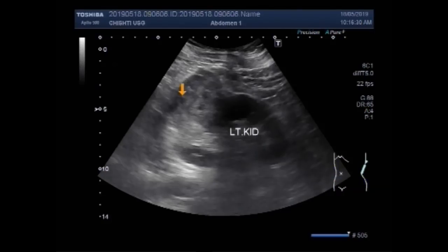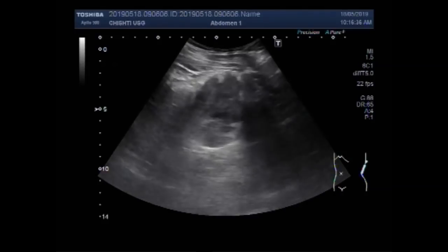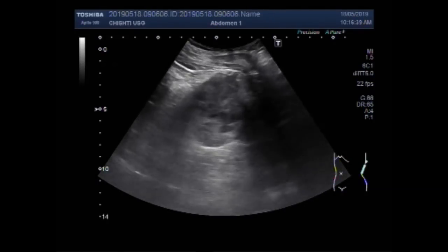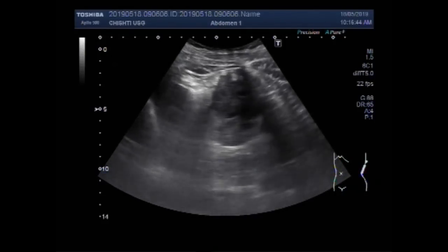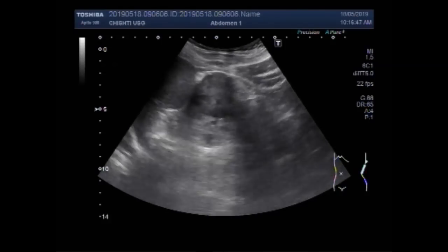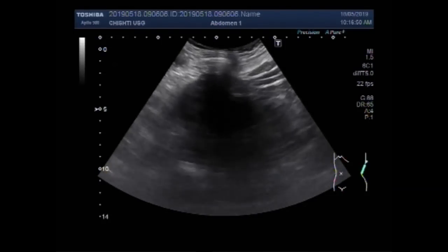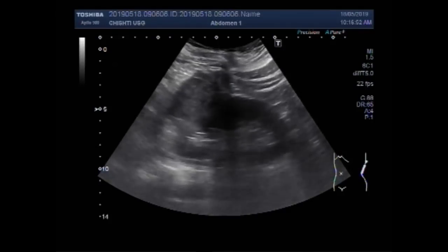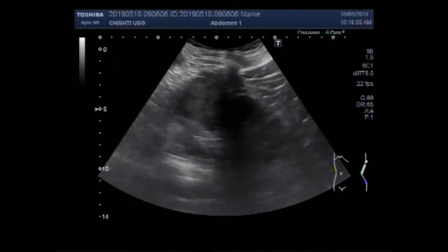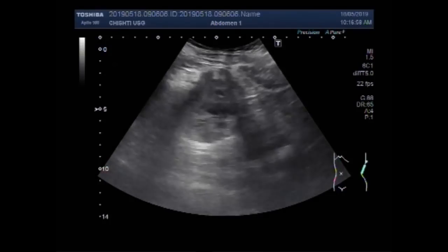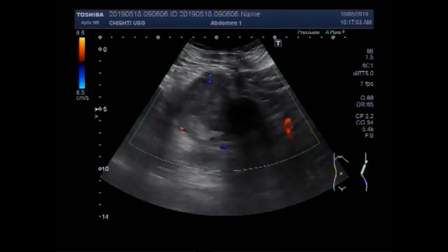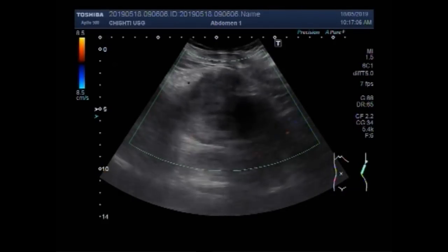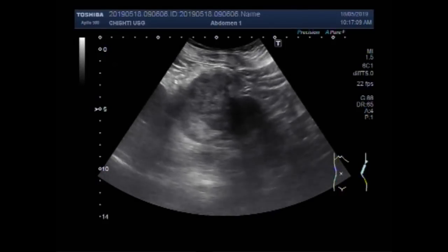This is the left kidney. This is the mass. The mass is round to oval in shape, semi-solid to solid in consistency, having heterogeneous echogenicity. And a fair amount of blood flow is also seen inside the mass.